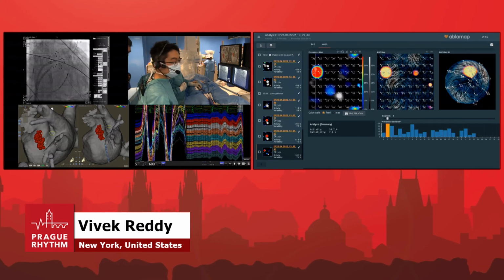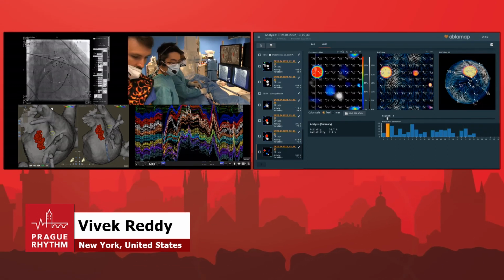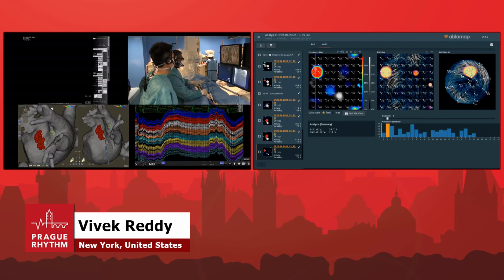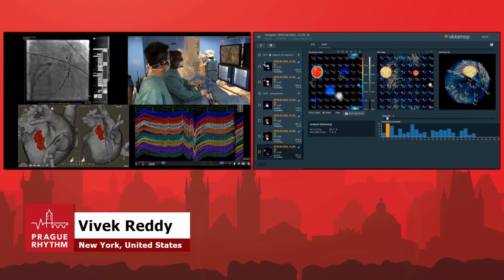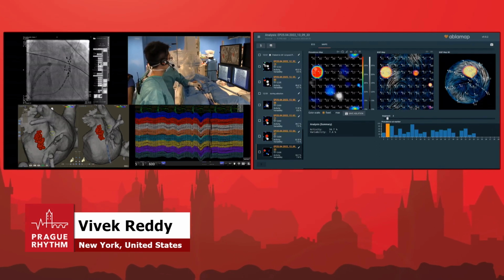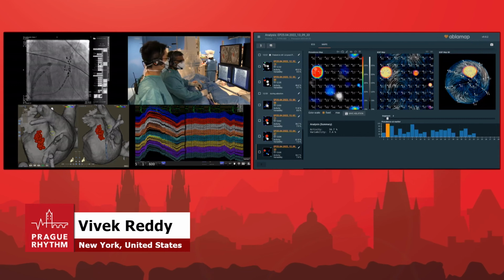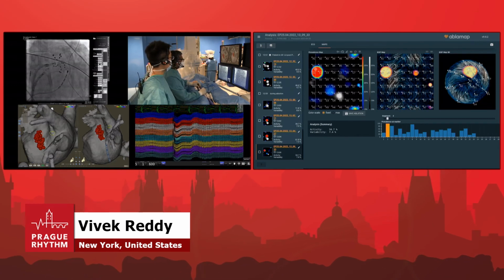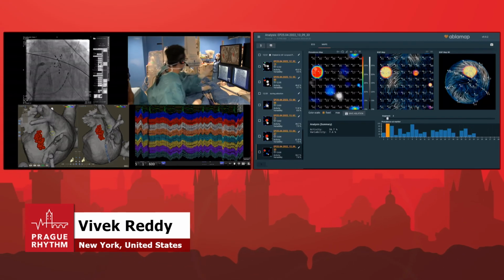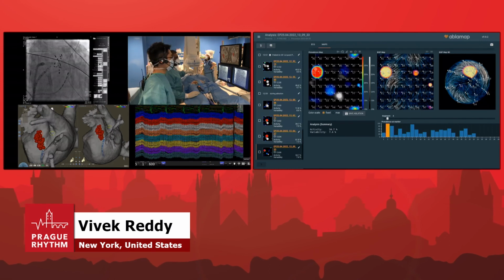Let's see here. I don't see it yet. There's some. Oh wait, no. Is it linked properly, Stefan? We don't see it. So if I understand correctly, you try to do lesions on the mitral isthmus, or in that area. Yeah, if we can't get this to work, we'll just take the ablation catheter and ablate with that.